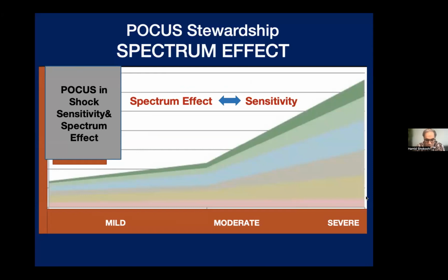So one component I want you all to remember, this is very, very important, and that is the use of ultrasound in different presentations. If everybody coming to your ER for any reason has a blood pressure a little bit less than 90, typically you give fluids, 1 to 2 liters, and done. So you say, okay, what does ultrasound help with this? Zero.